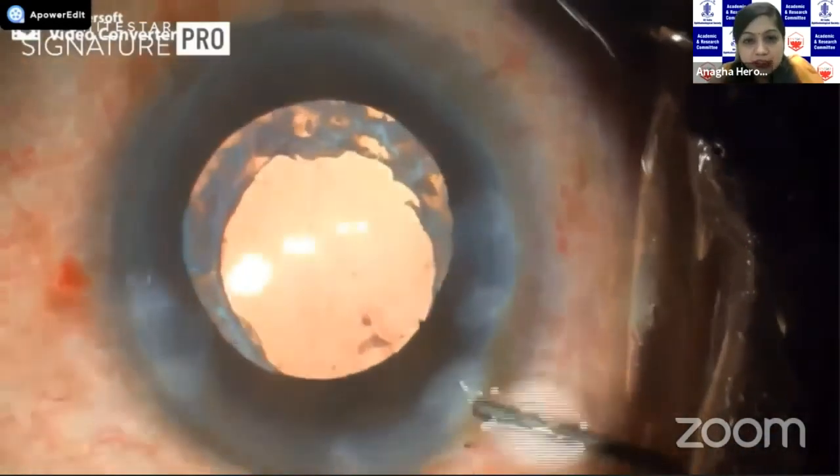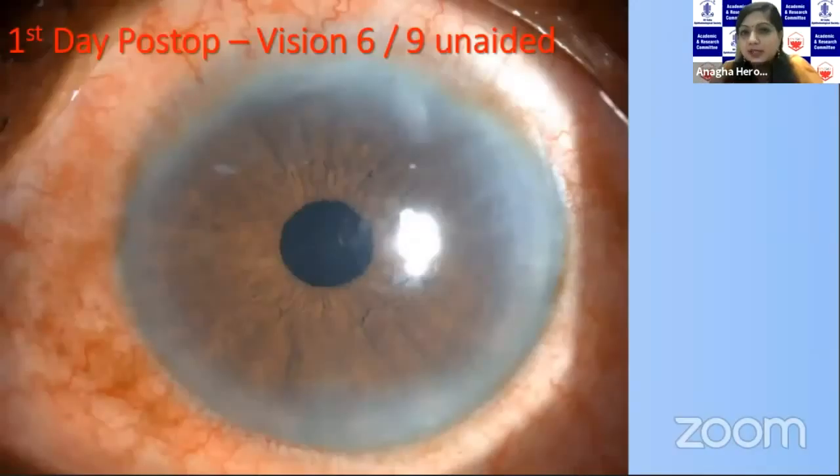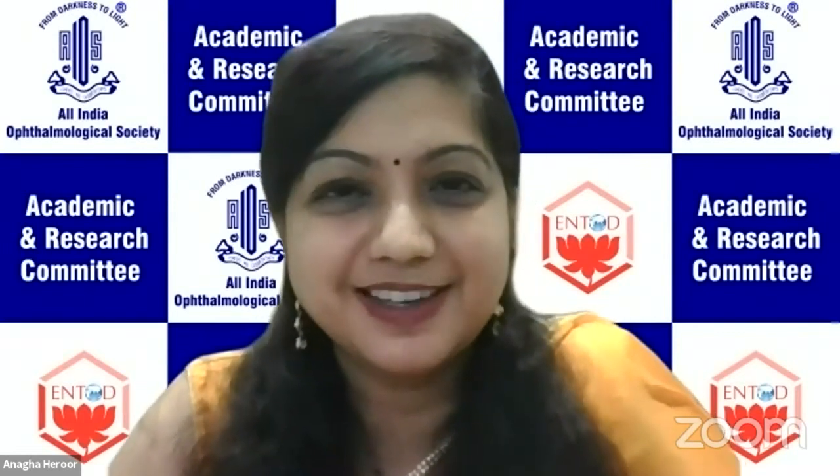This was the stromal hydration and the patient did really well post-op. Basically it was a hypermature cataract, and post-op the most important part was to achieve a strong circular rhexis, which would make the subsequent steps less risky. So this was what I had to present. Thank you so much.